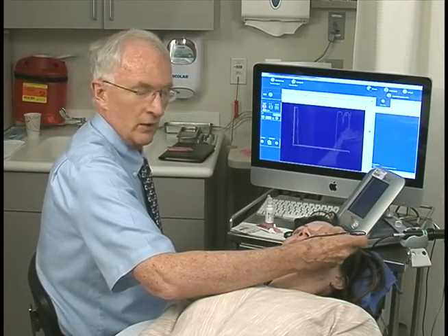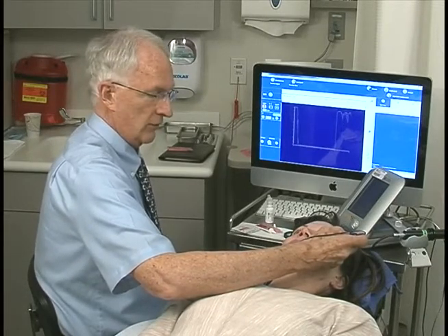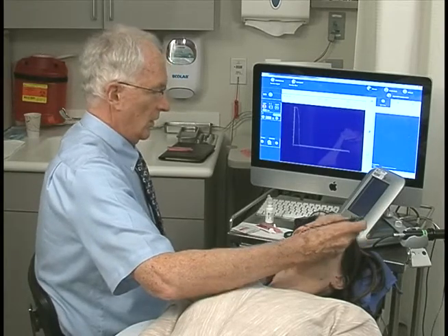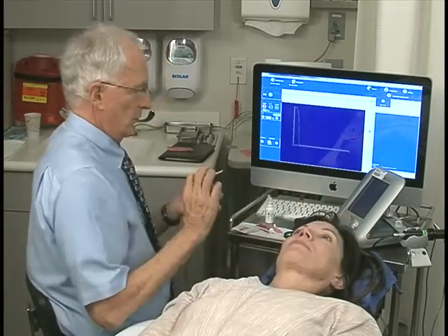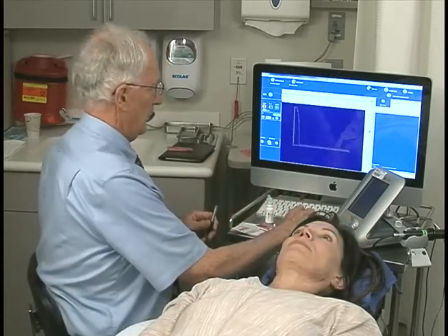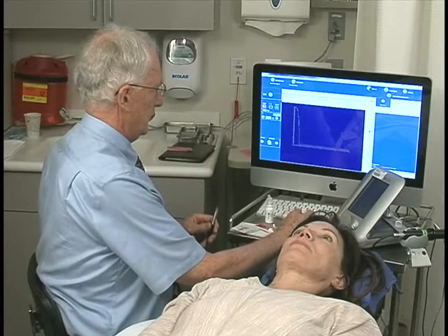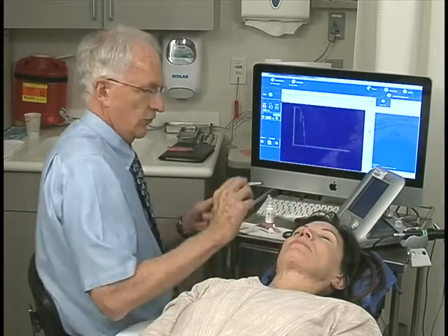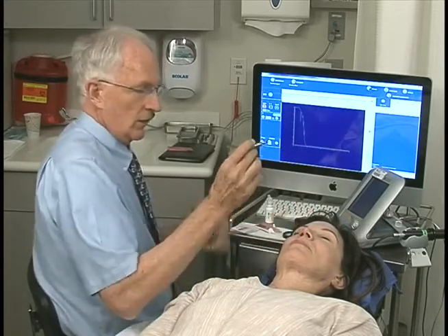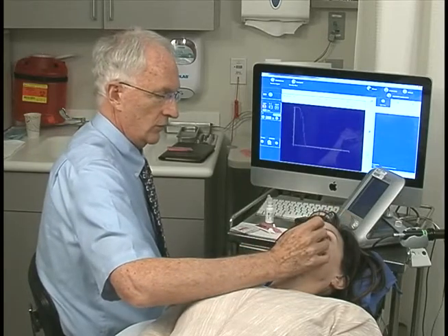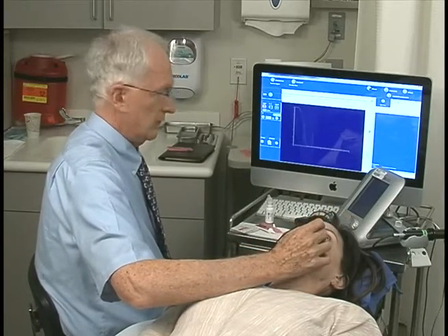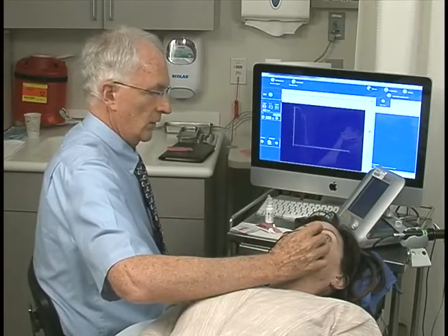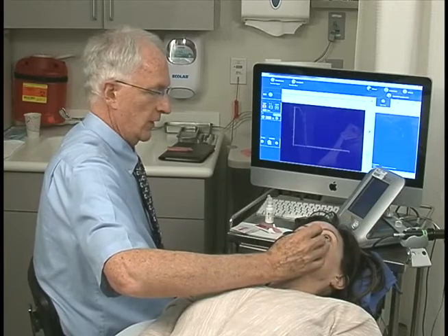In this patient, there's no pathology, so that's not demonstrated. I then can go to an orbital expansion, which simply has the same display in a more contracted view, allowing me to see the orbital tissue in a better display.